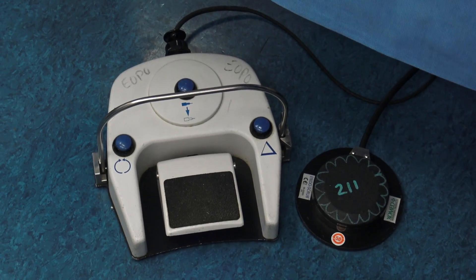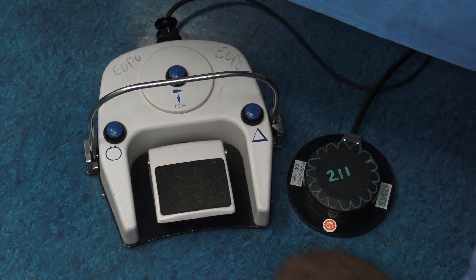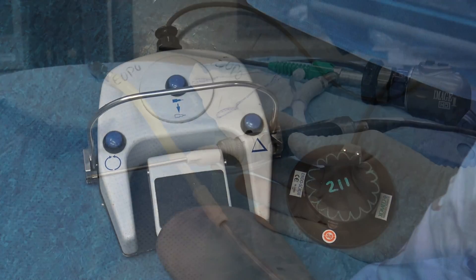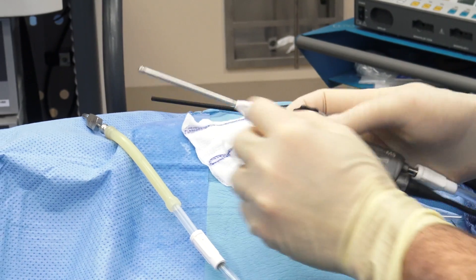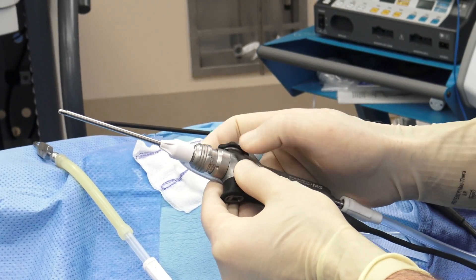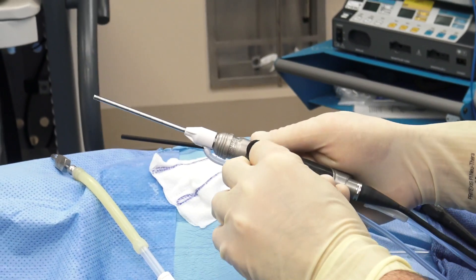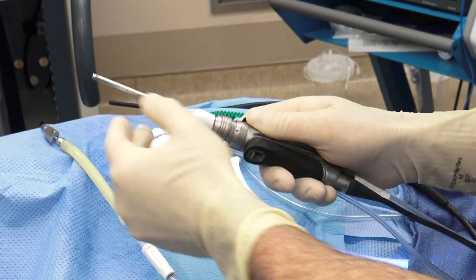I want to point out the microdebrider pedal — it has a number of functions. The center button simply turns the microdebrider on and off, as you can hear. With the microdebrider, spinning this circle will change the opening location, spinning it in a 360-degree circle. When you have an angled debrider, this will also lock or unlock it so the shaft can or can't turn in your hands.